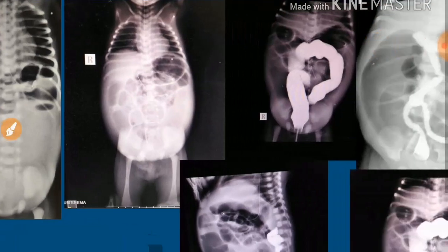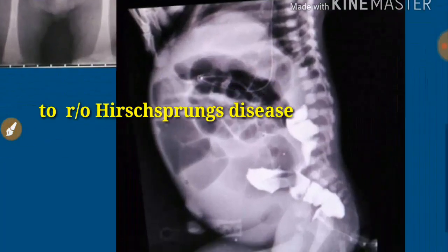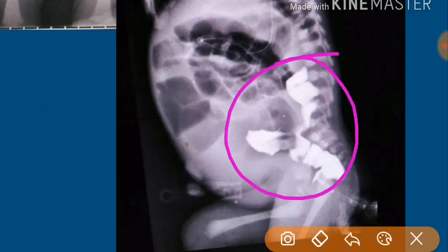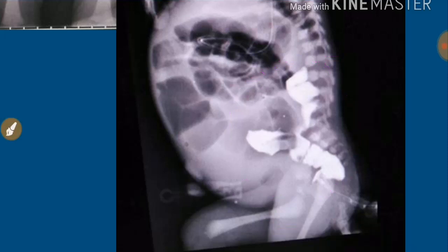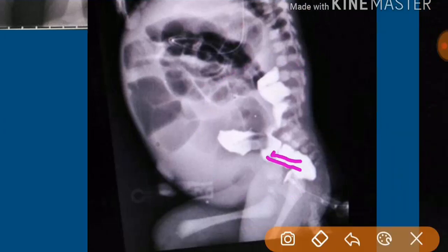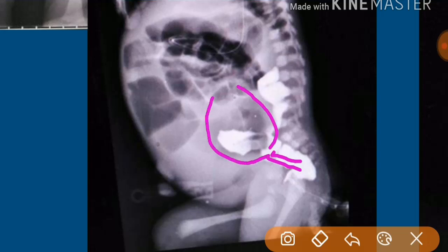After that, we put in the contrast — first to rule out Hirschsprung's disease. In Hirschsprung's disease, we expect a picture showing a narrow anorectal area with a dilated sigmoid colon, the classical transition zone in the rectosigmoid. In this case, we saw no classical rectosigmoid transition zone, so we ruled out rectosigmoid Hirschsprung's disease.